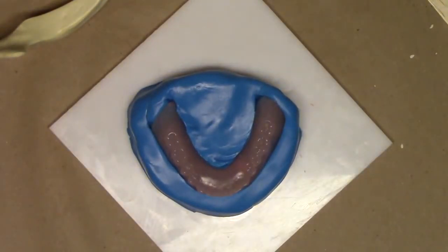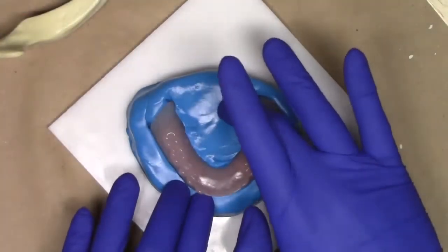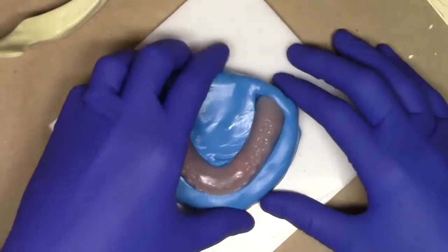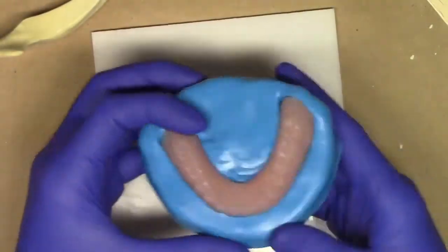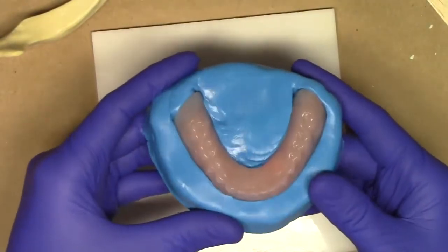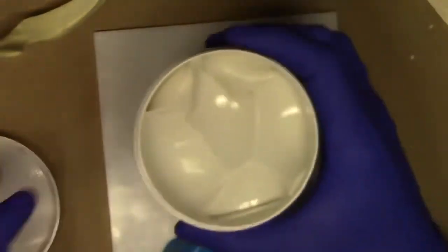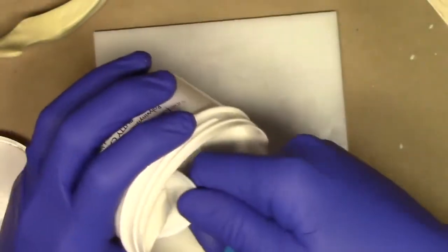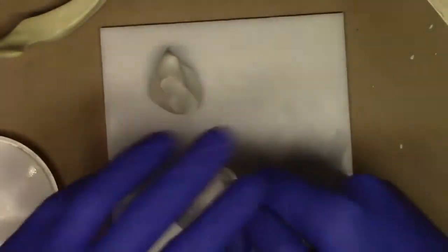Now at this point, we're going to let this material set until it's very firm to the touch. After a few minutes, the putty material is firmly set up. I can lightly separate it from my little plate that I have here. And the idea is I want to leave this denture in place. At this point, I can measure out an additional 6 scoops of putty, or if I'm using the base catalyst putty, it's 3 and 3.